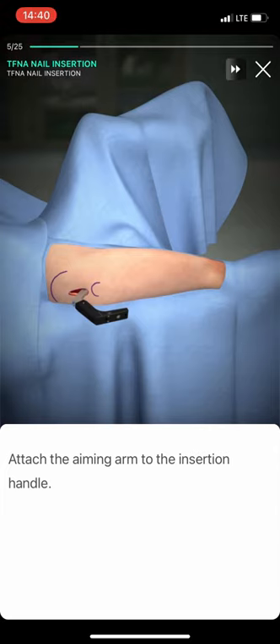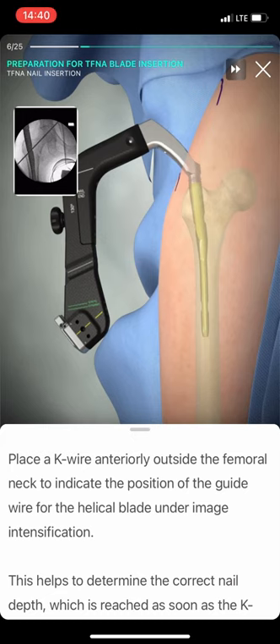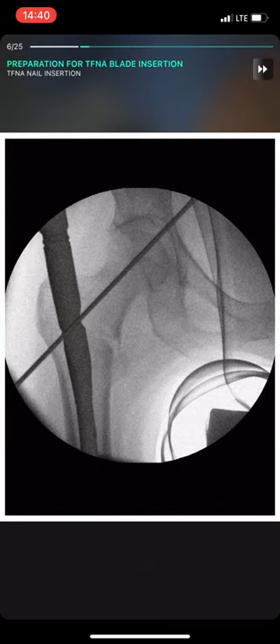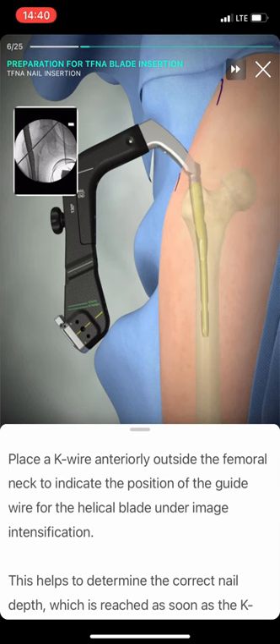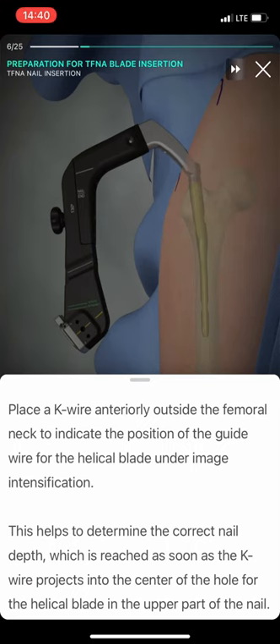Attach the aiming arm to the insertion handle. Place a K-wire anteriorly outside the femoral neck to indicate the position of the guide wire for the helical blade under image intensification.